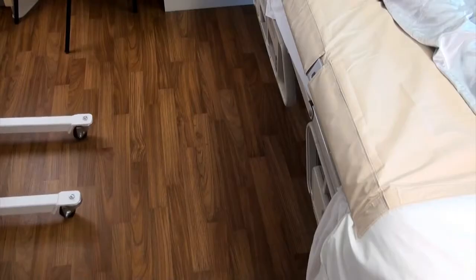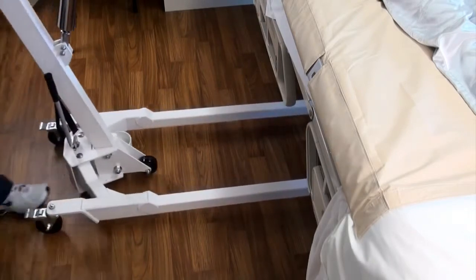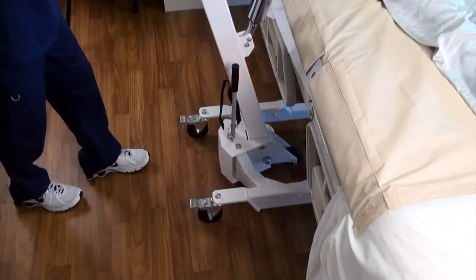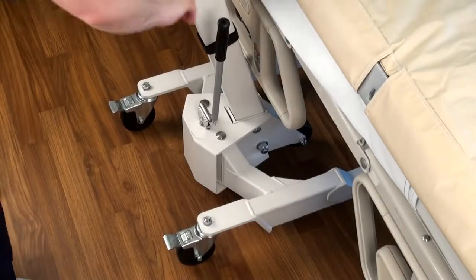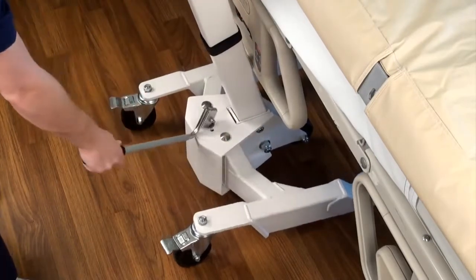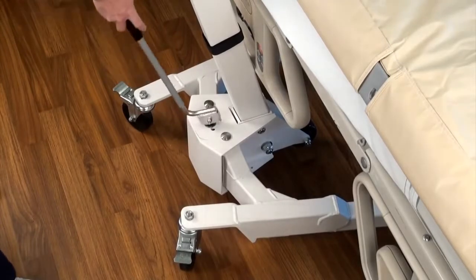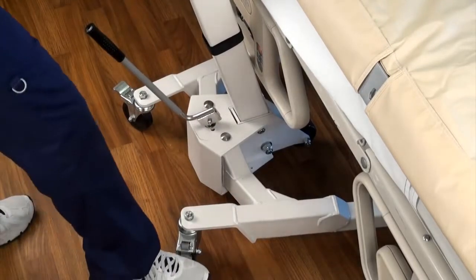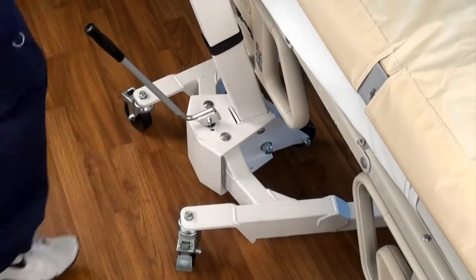Once the stretcher is in place, roll the scale forward so that the base is underneath the bed and the stretcher support hoops are directly over and safely above the patient. Widen the stance of the base by adjusting the base handle away from the column and rotating it until the legs widen as much as necessary. Return the handle to its vertical position to lock the legs into place. Set the brakes on the rear wheels to ensure that no movement in the scale occurs during the weighing process.